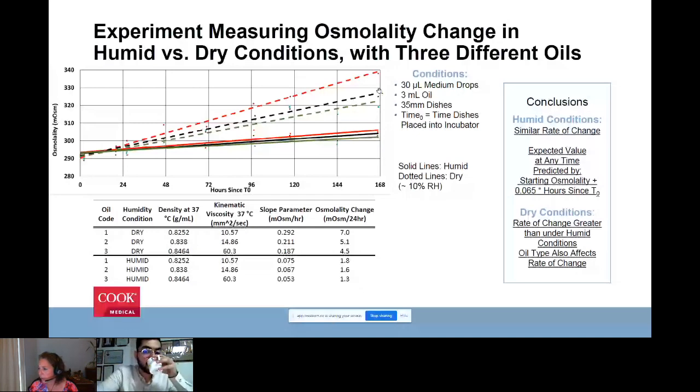I'm quickly going to have a look at the questions. Are the faster cleaving embryos good for transfer? That's probably something we need to check with the author on what results. No, so you mentioned here that when you have different conditions in the incubator, some of the embryos would cleave faster in a scenario, probably in a dry incubator as compared to a humidified incubator. So taking that point into consideration, do you think such embryos are good for transfer?